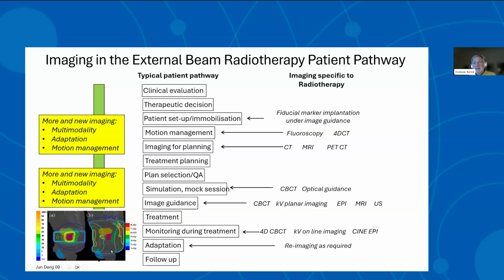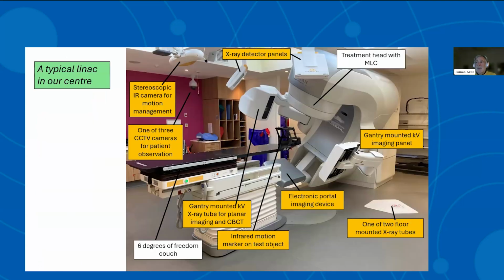You can also see in this small vignette in the lower left corner that the imaging dose on the right is distributed very differently from the therapy dose. As such, we need to consider two different dose distributions.